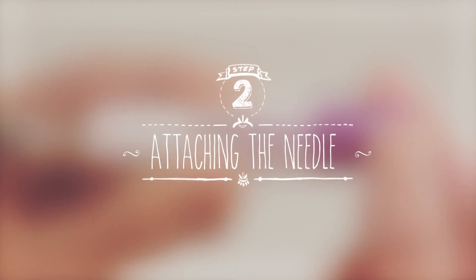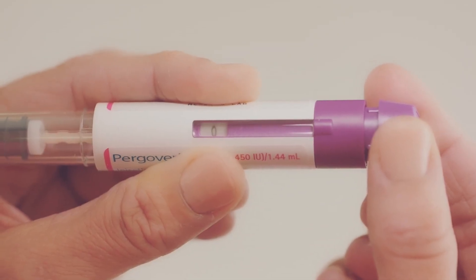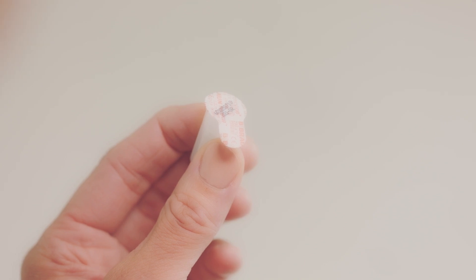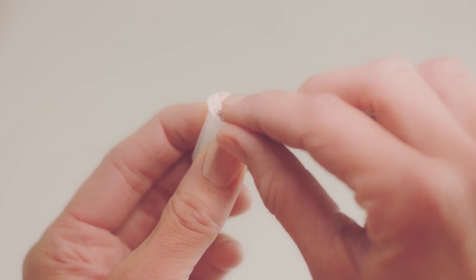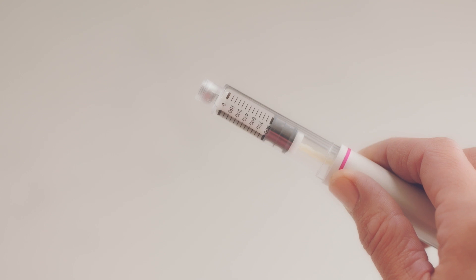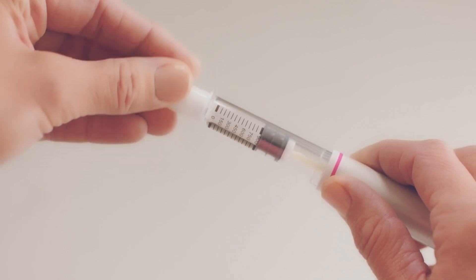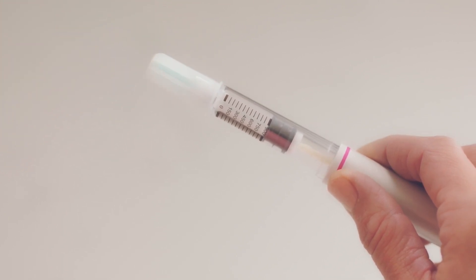Before attaching the needle, first check that the dose feedback window is set to zero. Check that the seal on the outer needle cap is intact. If it's damaged or loose, throw the needle away in a sharps container and use a new one. If you do need any new needles, contact your clinic or pharmacist. If the seal is okay, simply peel it off. Put the threaded end of the pen onto the outer needle cap and screw it in until you feel a light resistance — not too tight though, or it might be hard to take it off again.